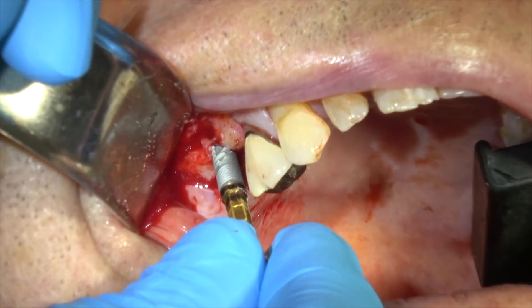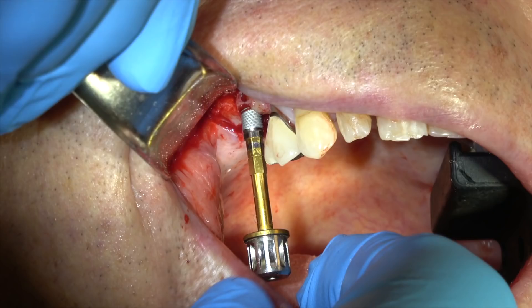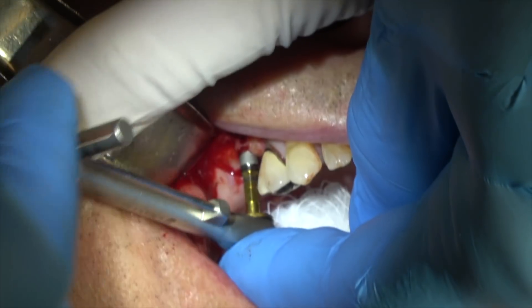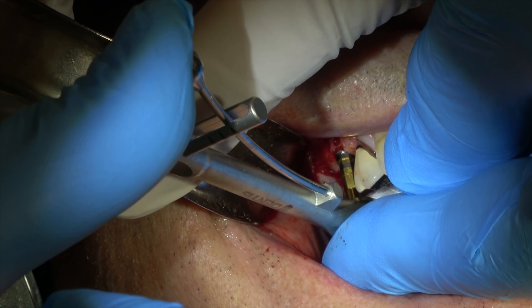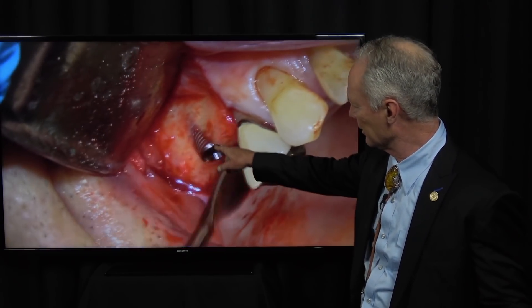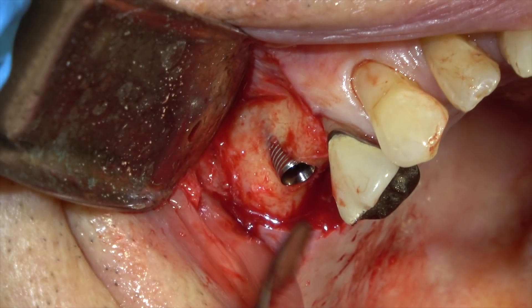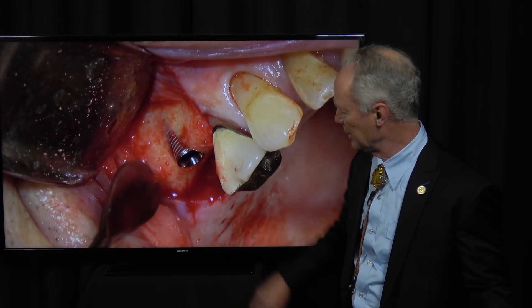Select the proper implant, hand-tighten, then use the ratchet wrench. In a perfect world, we screw the implant in to 37 newton-centimeters of pressure — and we were able to achieve that when it was screwed to place. You can see we've got this dehiscence right here, so I'm removing any soft tissue and I'm going to bone graft that dehiscence. The rest of the implant is just slightly apical to the alveolar crest.